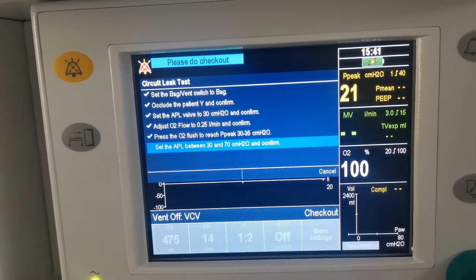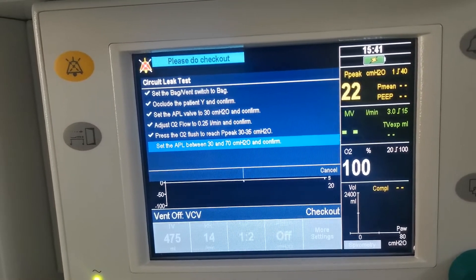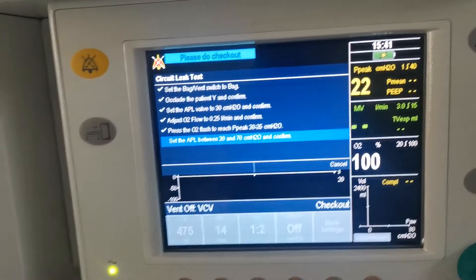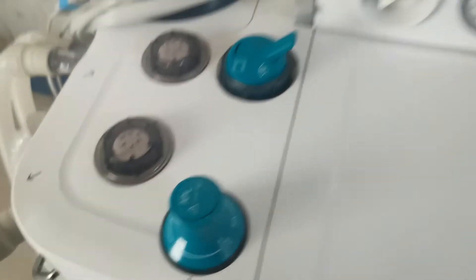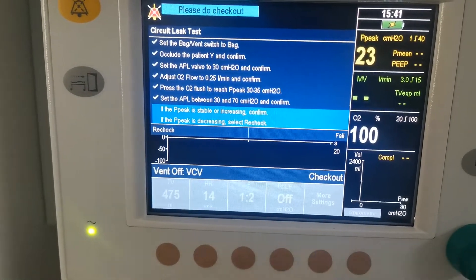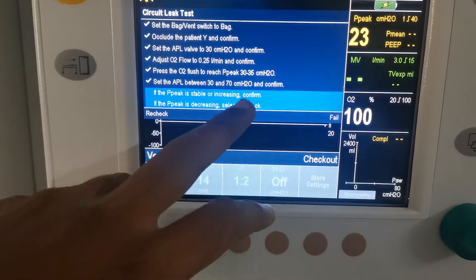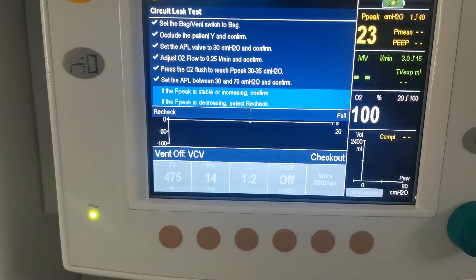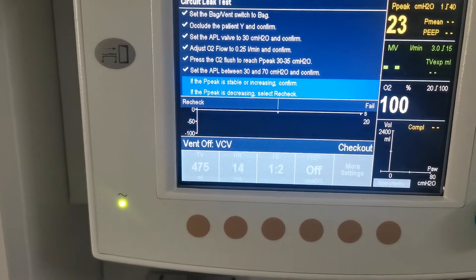Then set the APL between 30 and 70. You can come here and keep it to 30 and 70, then you press it. So if the peak is stable or increasing, confirm — so the peak is stable.